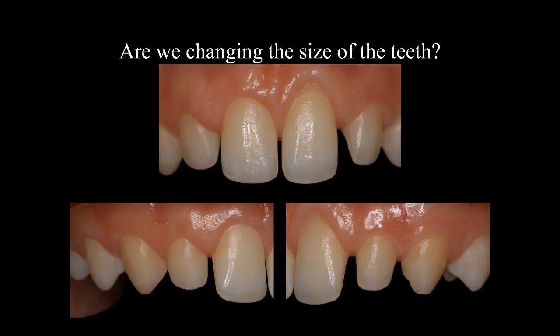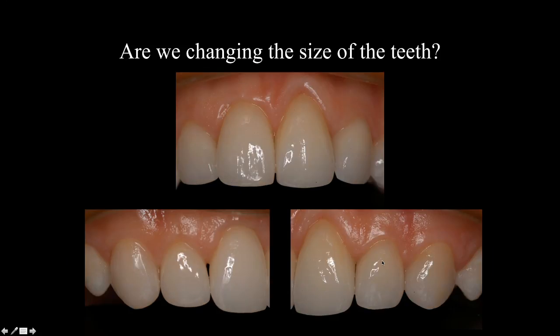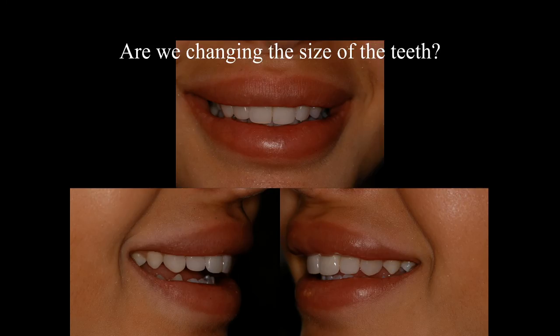As you see, almost prepless veneers, just a minor finish line on the proximal area, on the marginal area. In this situation, on the left central of the patient, the margin was supragingival in the enamel, not to go into the dentine. Only four teeth were prepared, polished, and the veneers were given to this patient, the six teeth from canine to canine. The size of the teeth was augmented.